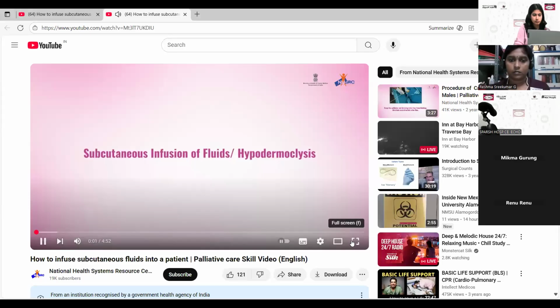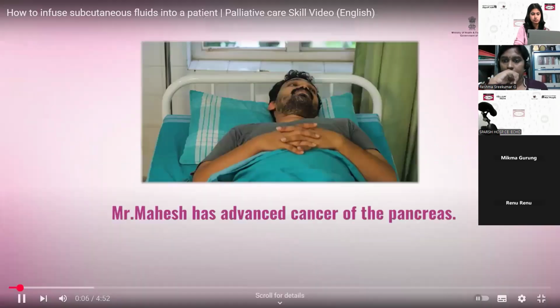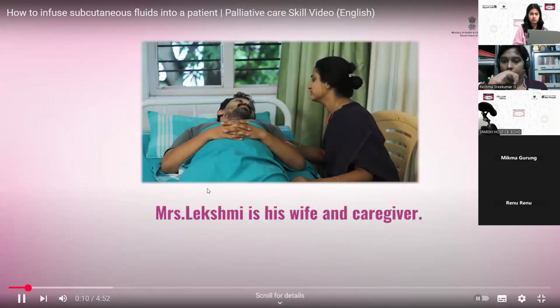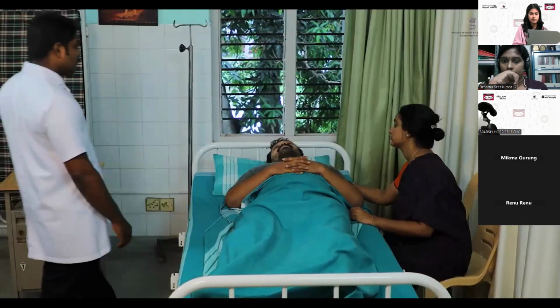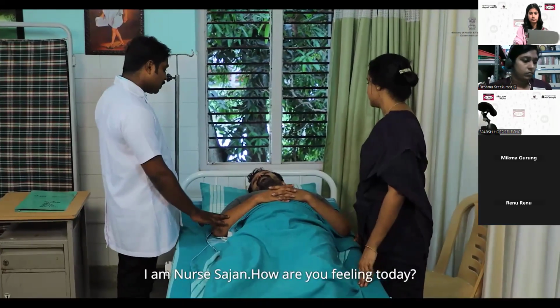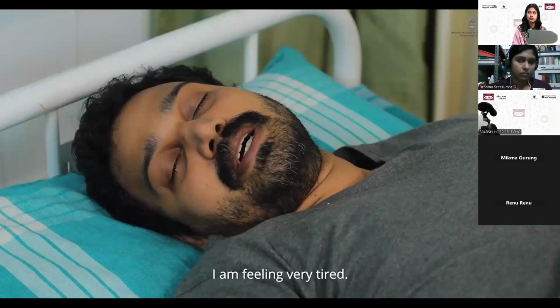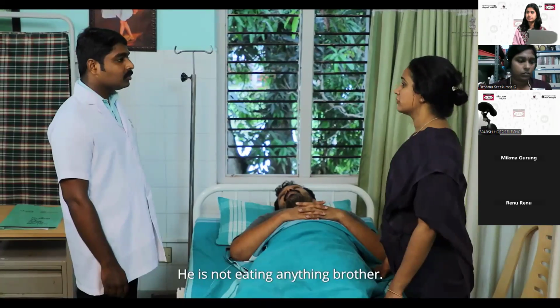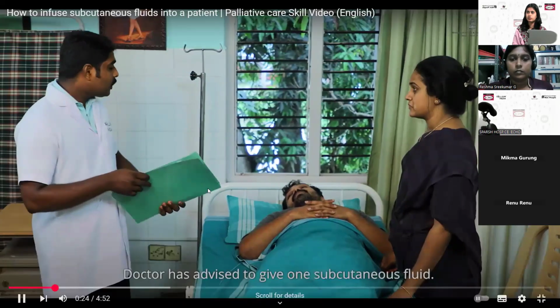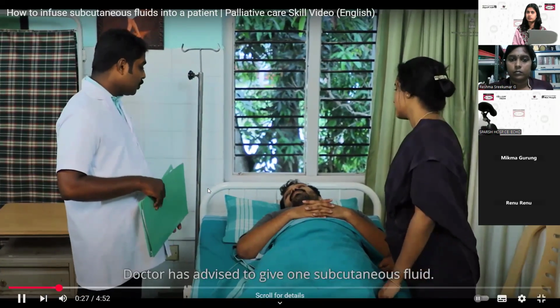Subcutaneous infusion of fluids or hypodermoclysis. Mr. Mahesh has advanced cancer of pancreas. Mrs. Lakshmi is his wife and caregiver. Good morning, Mahesh. Good morning. I'm Nurse Arjun. How are you feeling today? I'm feeling very tired. He is not eating anything, brother. Doctor has advised to give subcutaneous fluid.